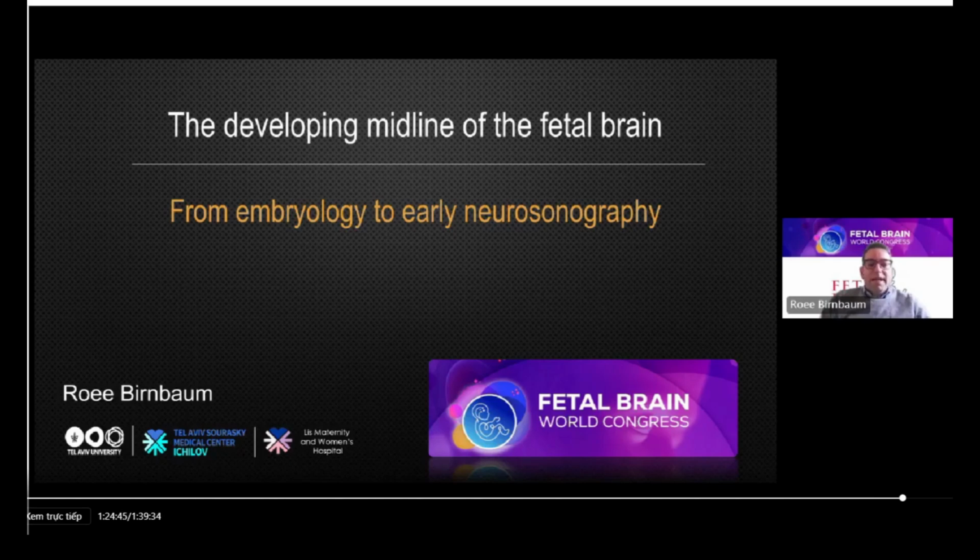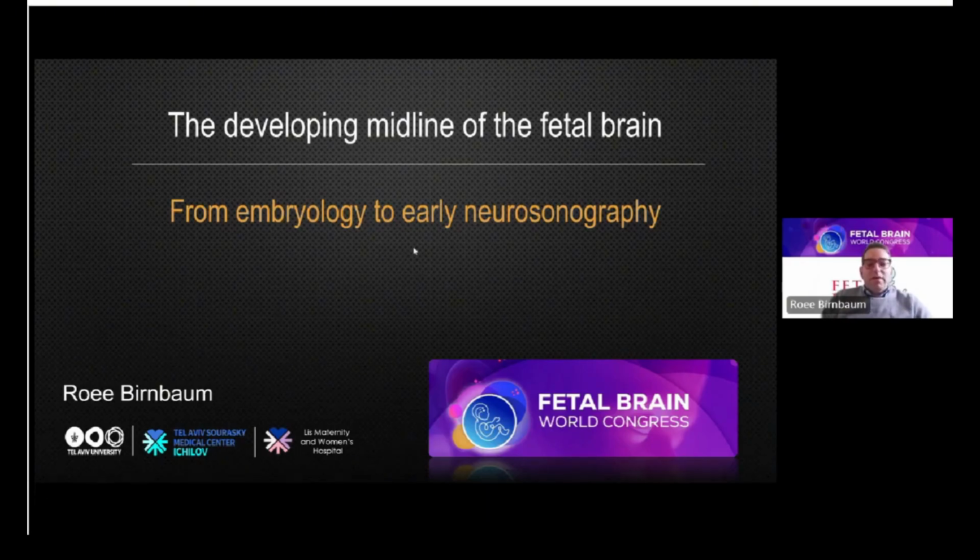The development of the midline. I will divide my talk into the embryological part, to try to go through the basic stuff and to simplify things as much as possible, and then we will move to the early neurosonography. So we are going to focus today on very small and early brain structures.